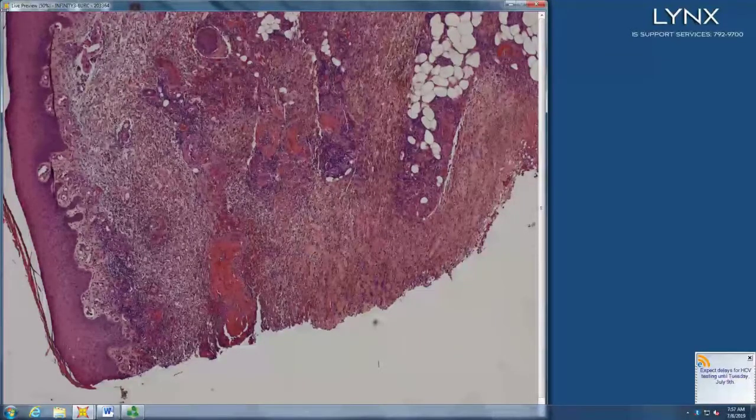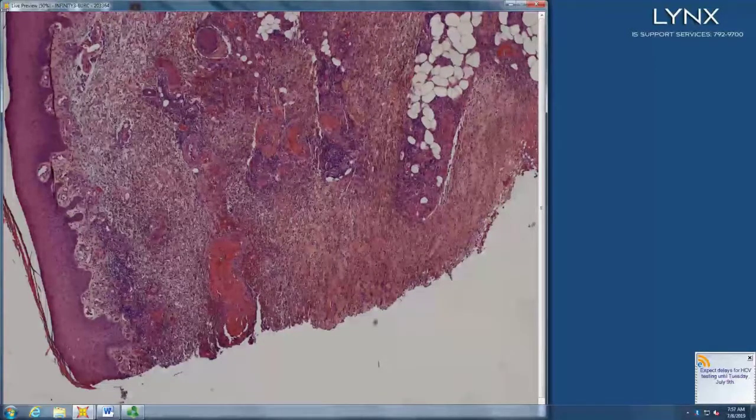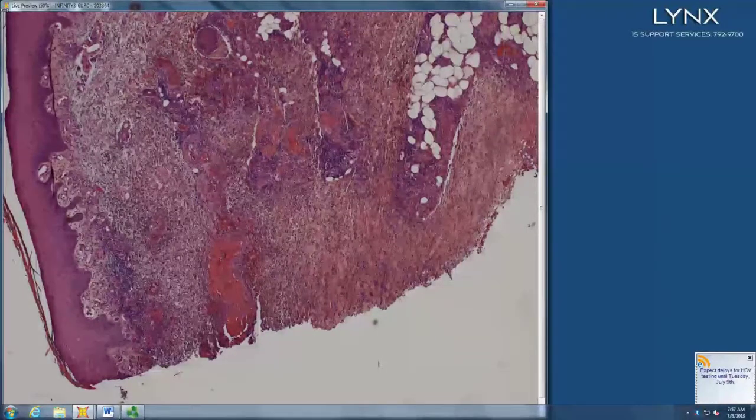Is this like a collagen vascular kind of thing? Or fibrin, or just LCV? So it could be an LCV, but there's a lot of clot, right? Yeah. So maybe thrombotic disorders. So name some thrombotic disorders.